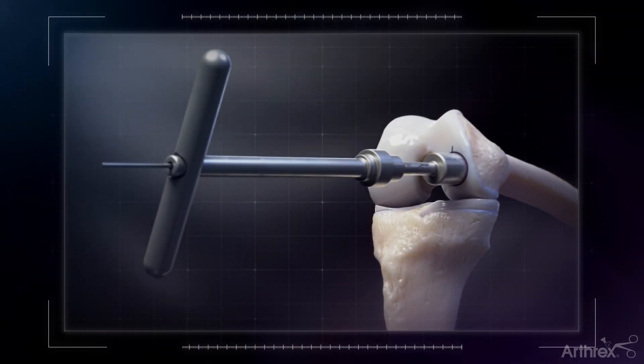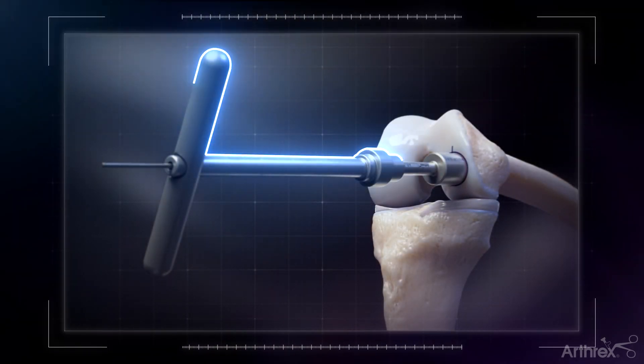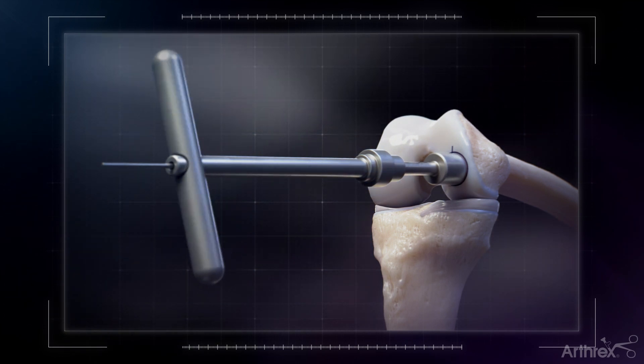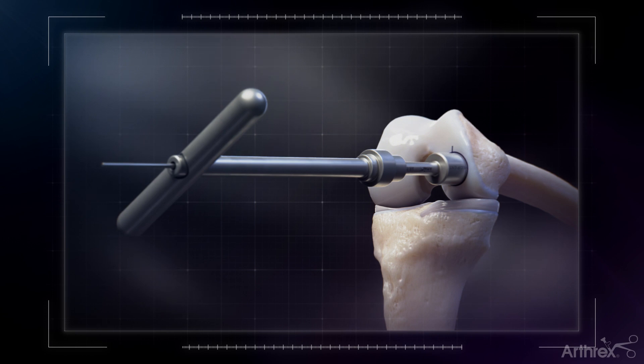Assemble the appropriately sized recipient scorer with the Quick Connect T-handle and 2.4 mm guide pin. Then, use it to score the articular cartilage to the subchondral bone.